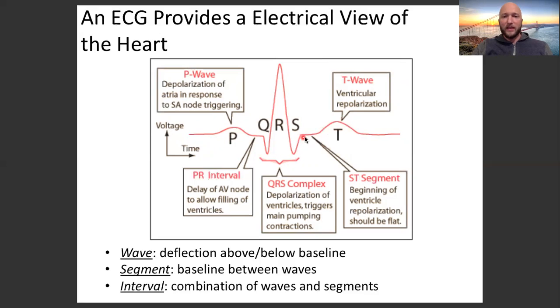Segment, ST segment, the baseline between waves. An interval, PR interval, it goes from P to R. P to R, a combination of waves and segments. And then we also have this QRS complex right here.